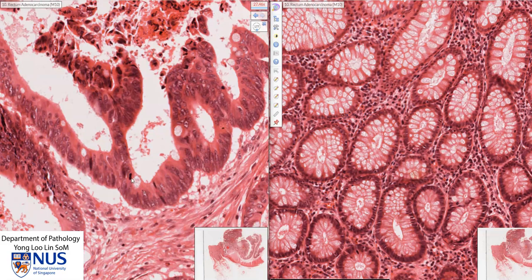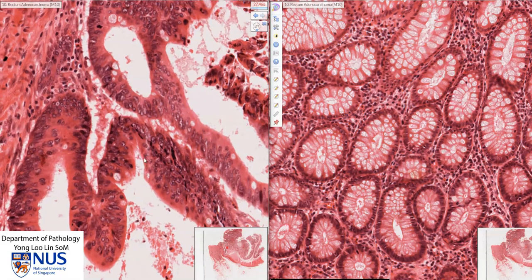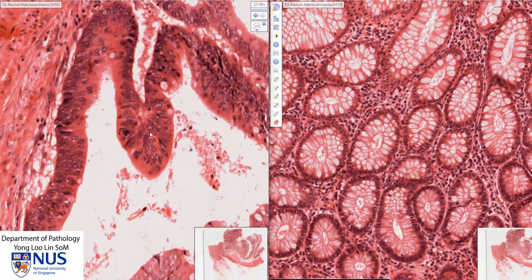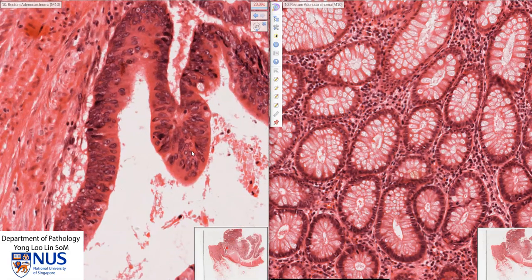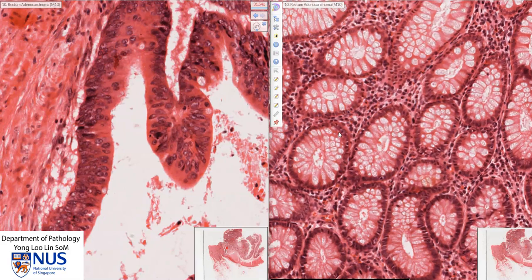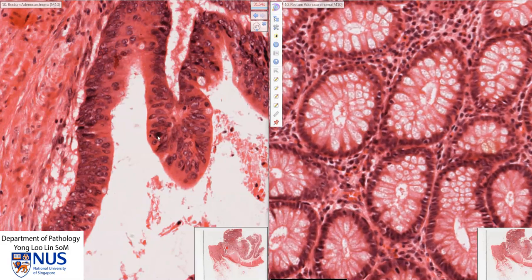For example, there is a mitotic figure here. Moving around, we can easily identify more mitotic figures — another one here. Notice how much larger the nuclei are. The nuclei are present at all levels of the cells; they are not nicely polarized or basally located — they are stratified.